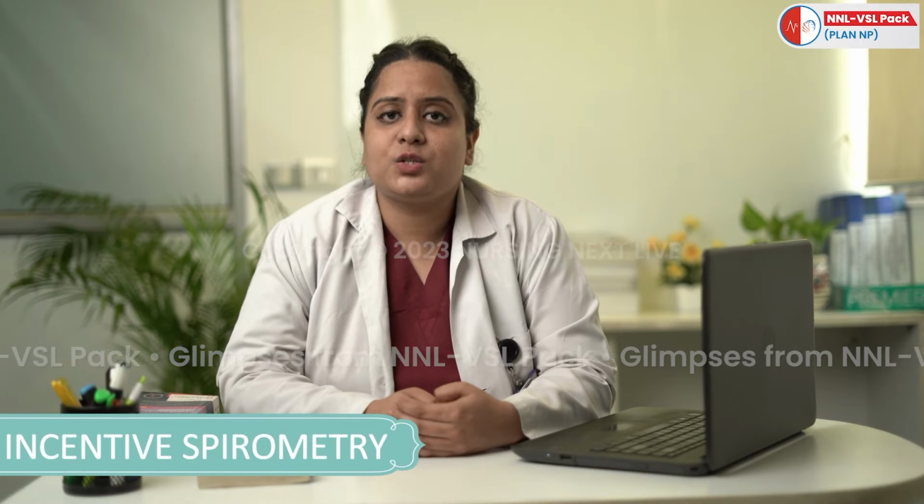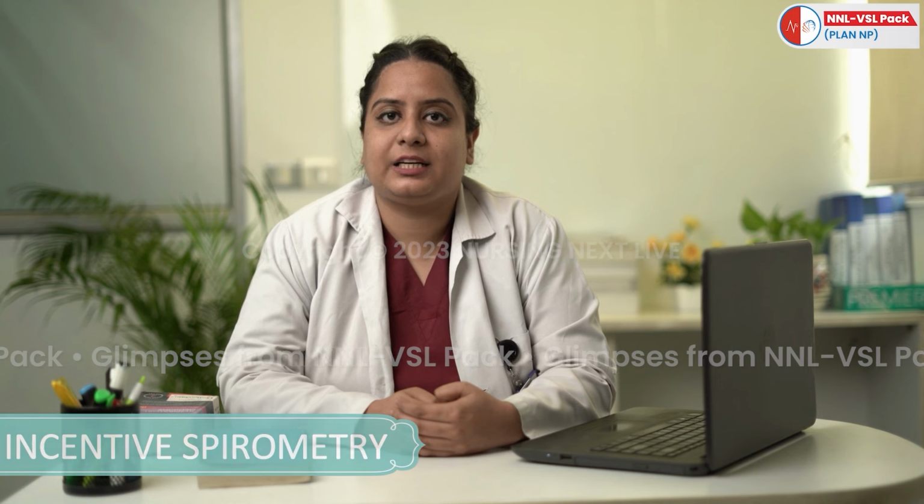In this video, a nurse will understand the various aspects of incentive spirometry, steps of procedure, equipment required, aftercare, and most importantly, what to do when things go wrong. In other words, common clinical errors.